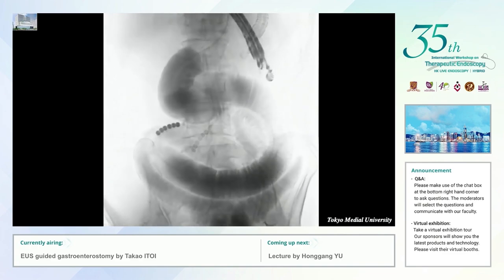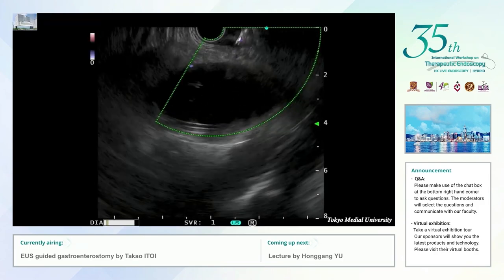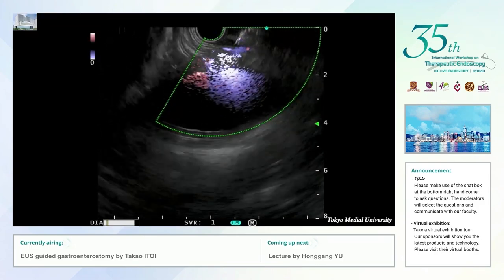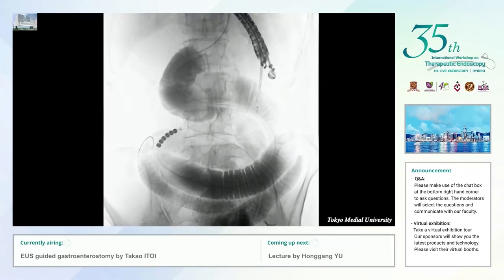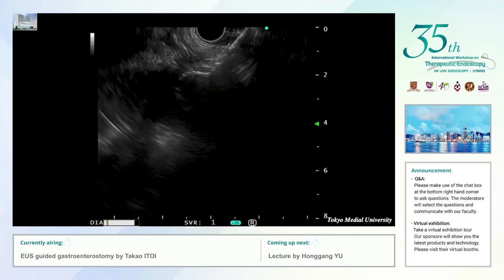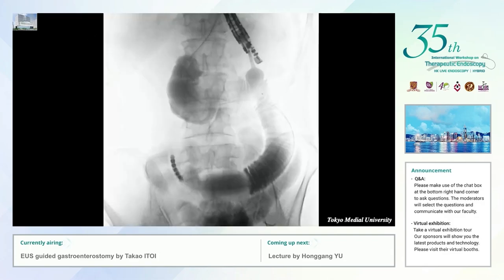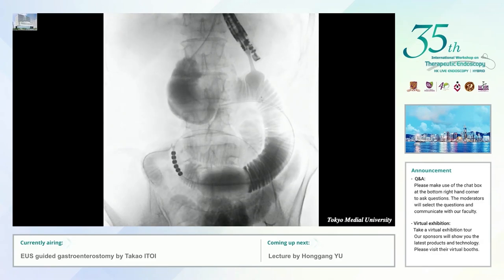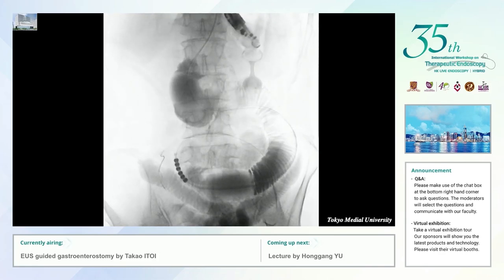So we injected the saline more and more, totally 150 cc. Then we could puncture from the closest position from the stomach. And finally, EUS-GE was completed without any complication. Like this.